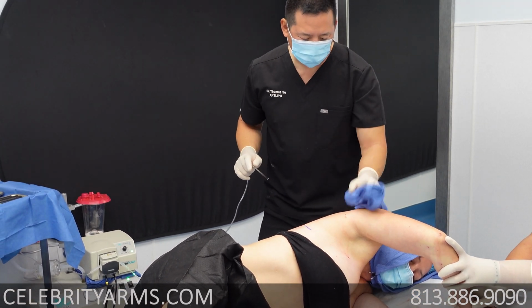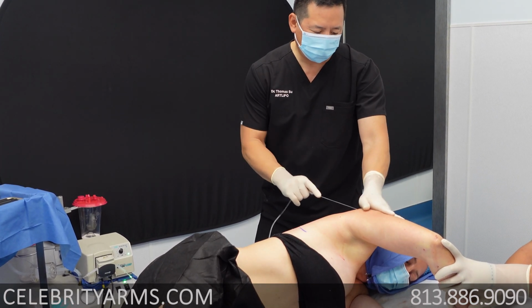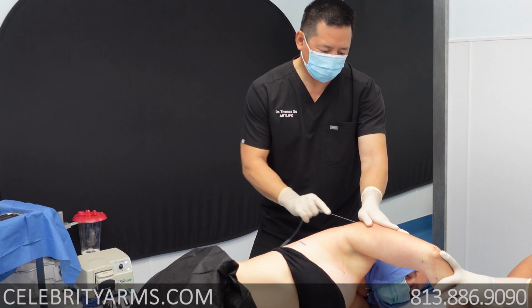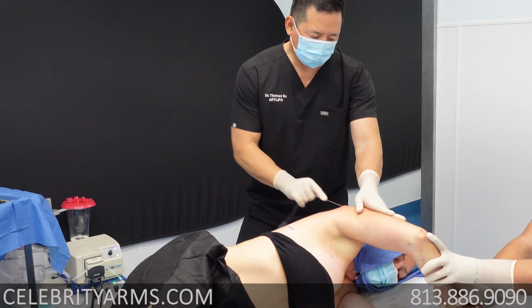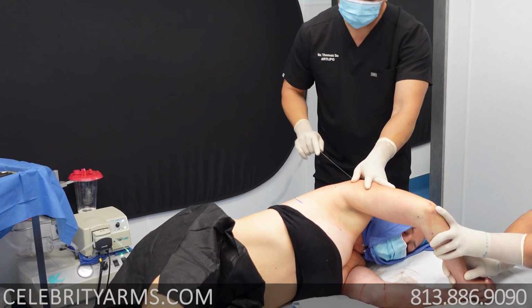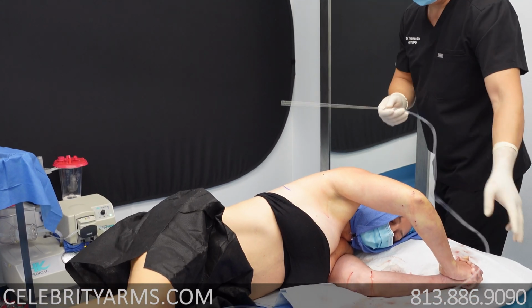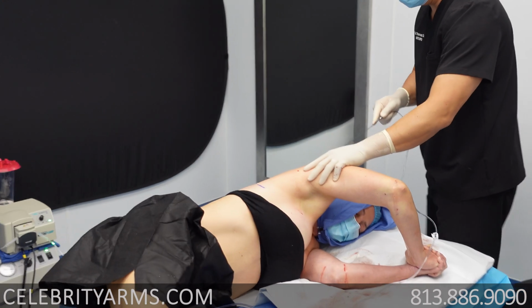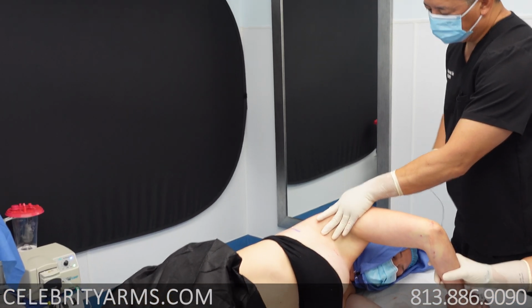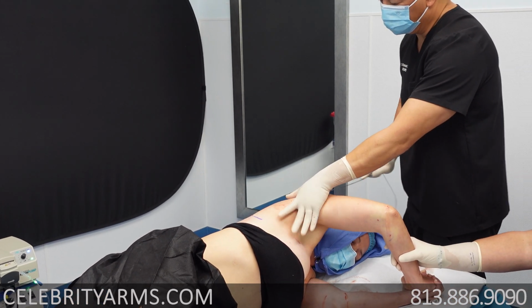One of the reasons I think that other doctors don't like to work in this area is if you don't sculpt smoothly, it's a very visible area, and you wouldn't want lumps and bumps. Right, looking with irregularities, divots, whatever you want to call them, in that particular area. Any doctor would get the fat, but whether they would sculpt out that nice shape is a whole different thing. So this is the upper back area that we're working in right now.